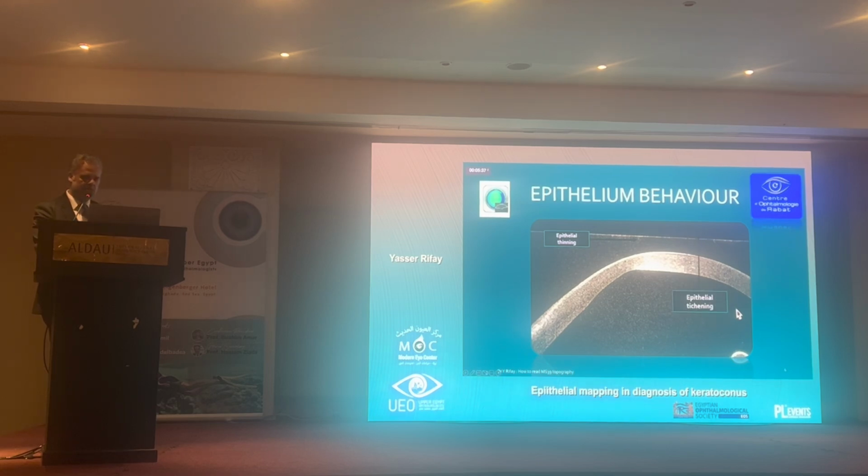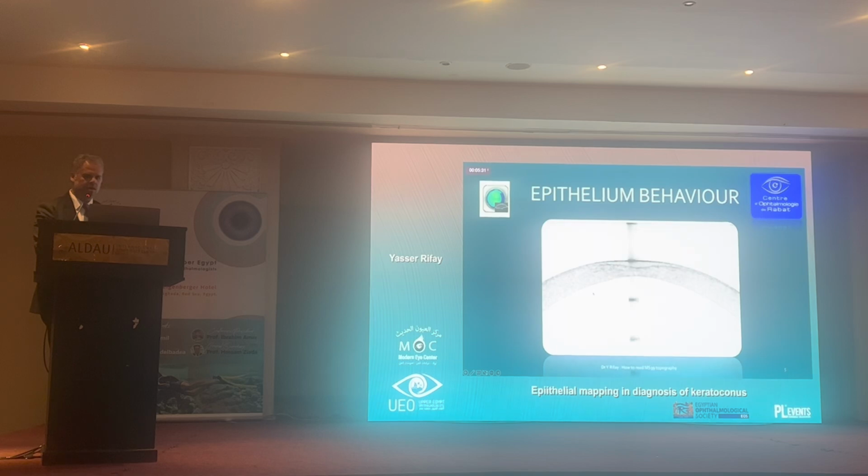So we have here the epithelium. It is thinner here and it is thicker in this place. It fills the gaps. So when we have scars, the epithelium comes to fill the gaps.